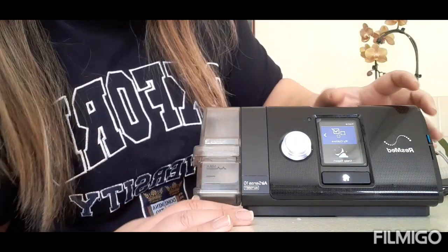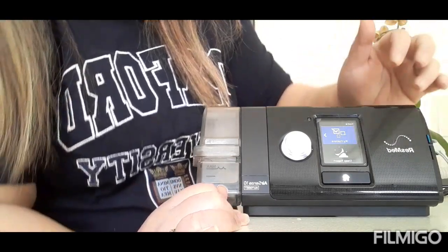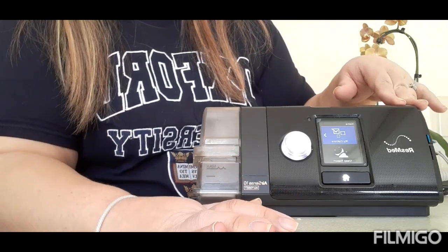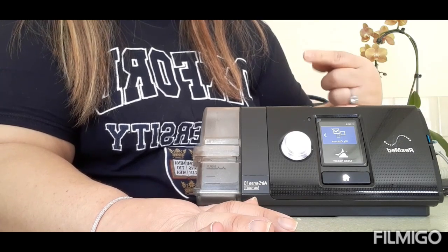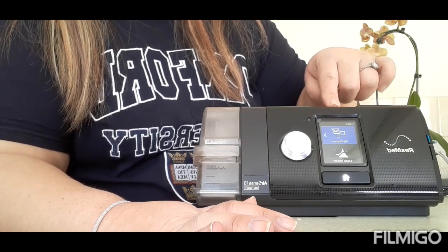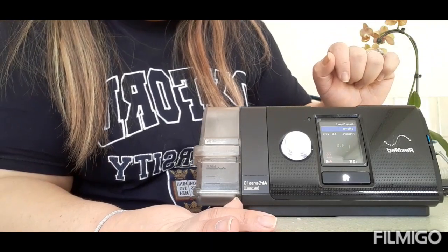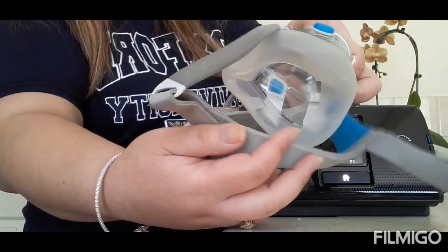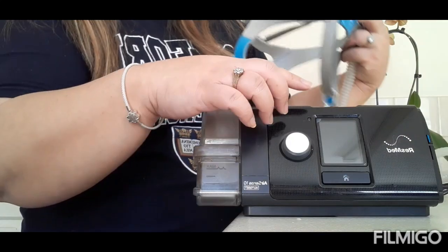As you can see in there, those are my options and everything. And everything about that, they'll do that in the hospital before they give it to you. They put a certain pressure into whatever air you need in your body. And this is the switch on at the top, and then you just switch it on, and you can see now it's working. There you go, guys. You can hear that, it's the air. There you go.